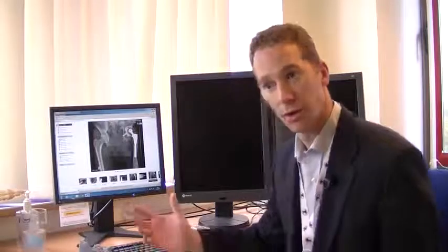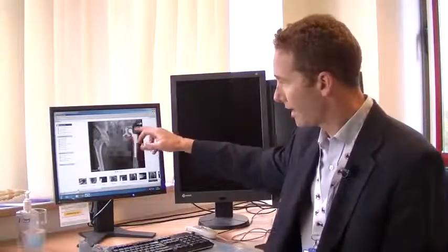to allow me to finish the surgery safely. So I've got an example of a 61-year-old who I operated on using the model to plan my surgery. He'd previously been involved in a road traffic accident in his 20s. He'd had a pelvic fracture, a thigh bone fracture, a shin fracture, so multiple injuries. And he subsequently had a hip replacement at a very young age, in his 40s. Now the hip replacement has failed, and if you look on the x-ray, it's failed with a lot of bone loss around where the socket would be, around the acetabulum.